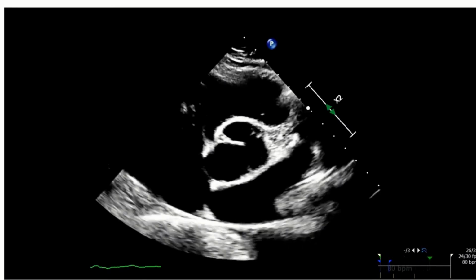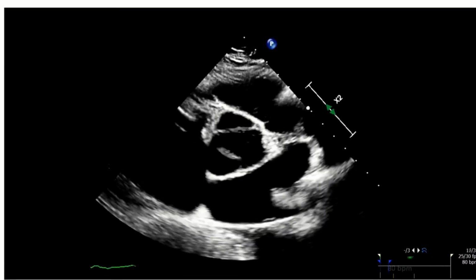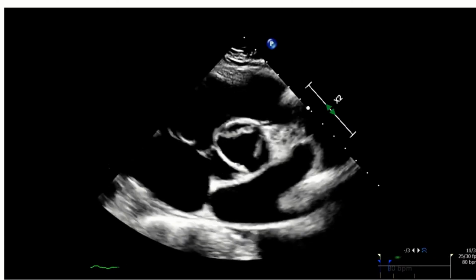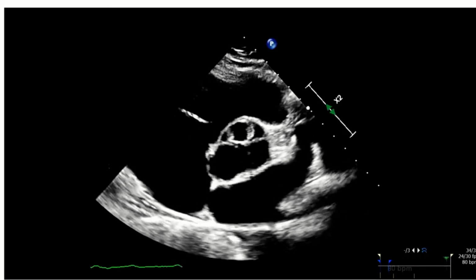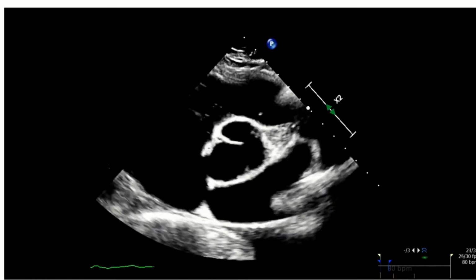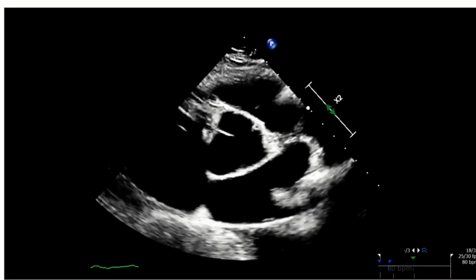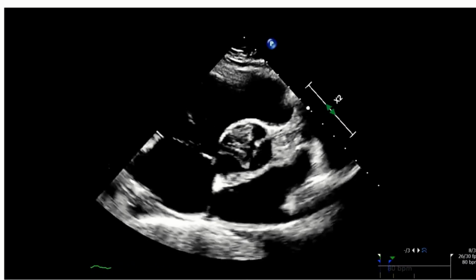And this is how we look at it. This is one of the pictures. When we get a 2D echocardiogram, we try to slice the heart in different ways, and we put our probe in very specific locations to get the pictures. So the next time someone comes in, they can get the same picture again to be able to compare to the previous one.